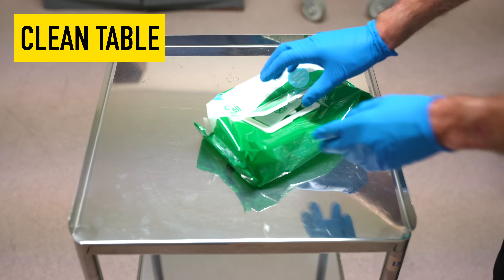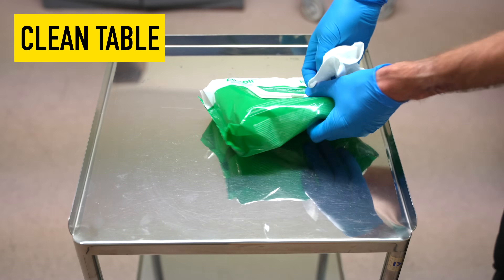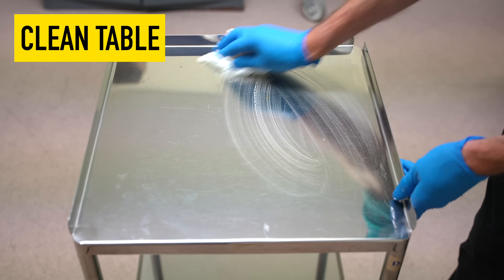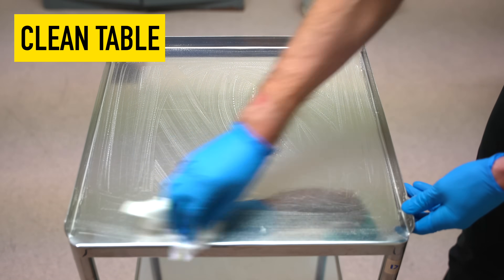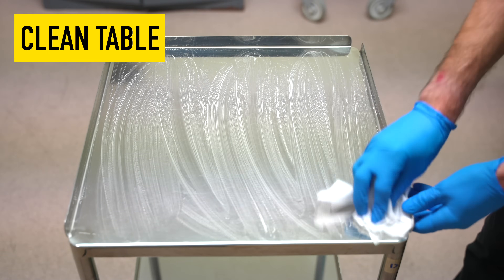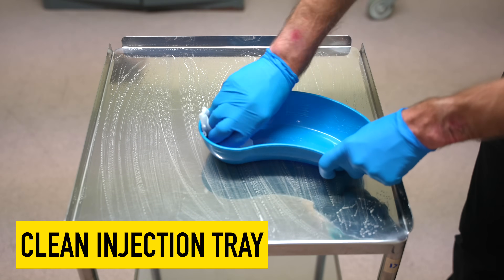So I'm just going to check the vials, make sure the dates are correct, and prepare the kit. If you'd be kind enough to raise up your right arm.